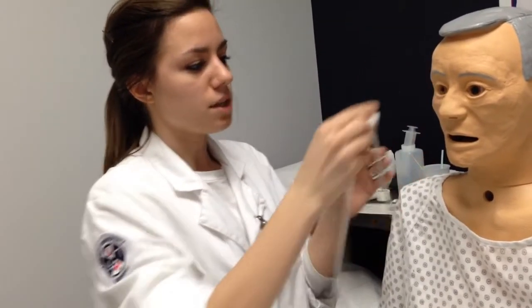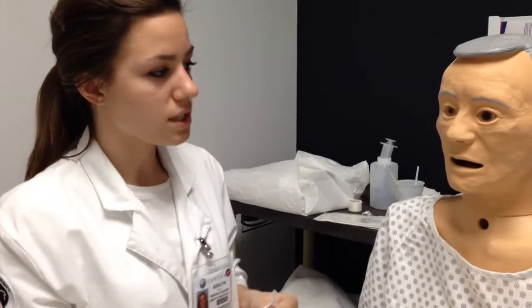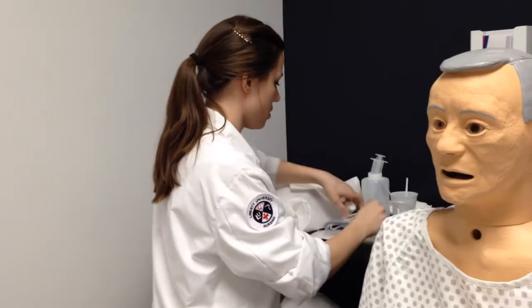And as I would perform an NG tube, I'd make sure that I would ask you if you ever had a broken nose or a deviated septum, or ever had a head injury. And that would conclude the NG tube insertion.